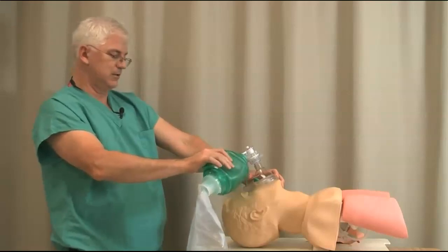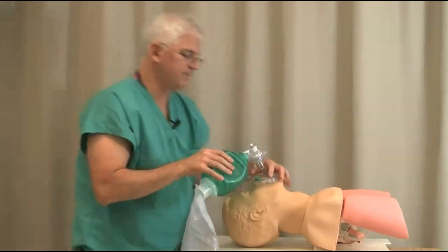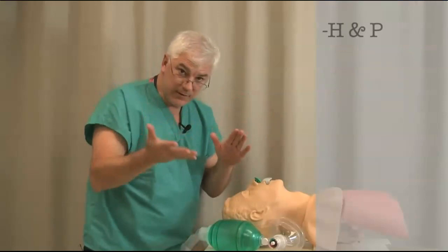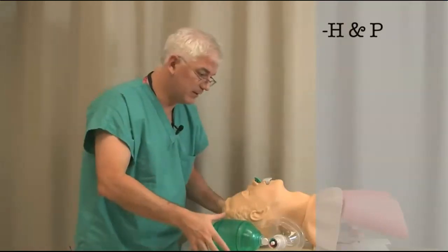This works. This doesn't work. Okay? So that's it for mask ventilation. Quick review. Do a history and a physical. See if there's going to be something problematic about masking them, like a beard or something.